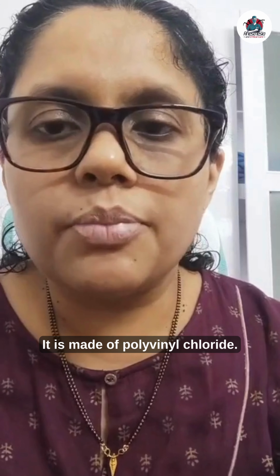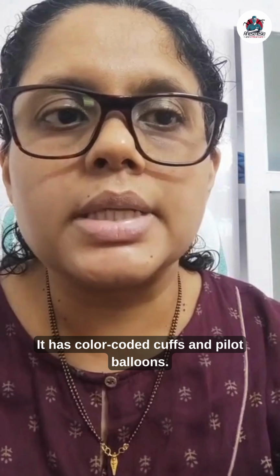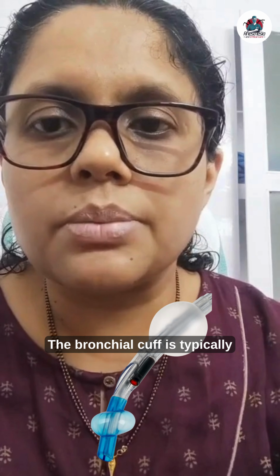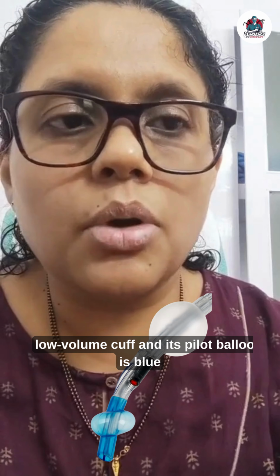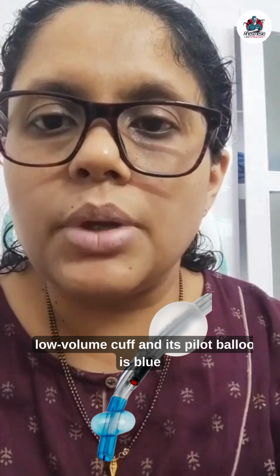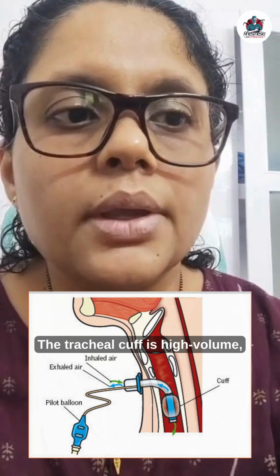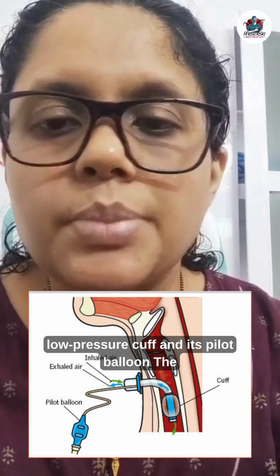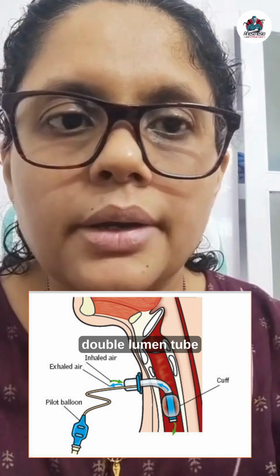It is made of polyvinyl chloride. It has color-coded cuffs and pilot balloons. The bronchial cuff is typically a high-pressure, low-volume cuff and its pilot balloon is blue in color. The tracheal cuff is a high-volume, low-pressure cuff and its pilot balloon is clear-colored.